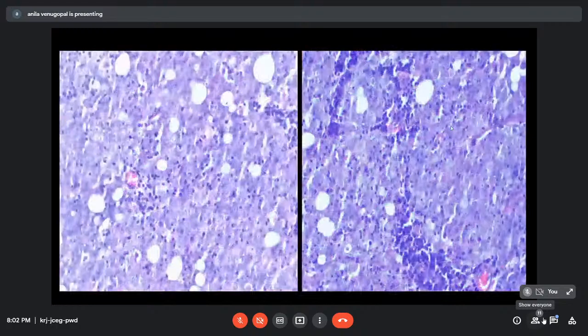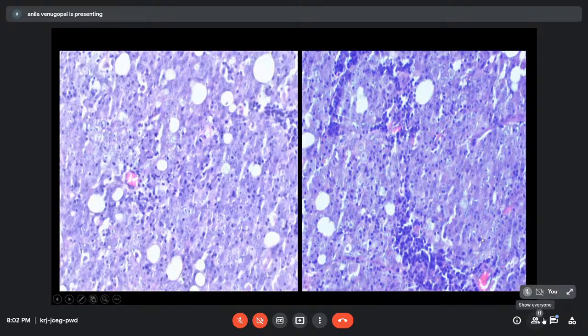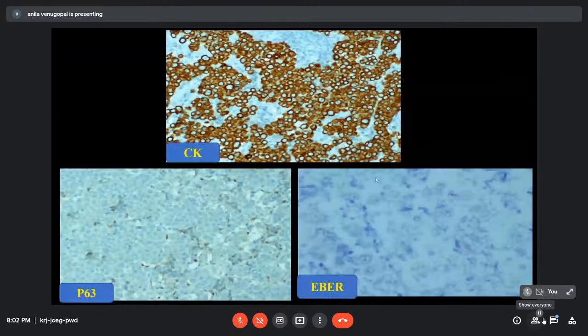This was the previous slide. The outside biopsy was also submitted for review, with similar cells, only with more nesting seen here with prominent nucleoli. Because we had this diagnosis of carcinoma only, the panel that we chose was cytokeratin, and then P63. We did both squamous markers, P63 and P40. Both were totally negative in our case, as well as in the outside blocks where we had done this immuno. Even EBER was negative, because the outside diagnosis was nasopharyngeal carcinoma.